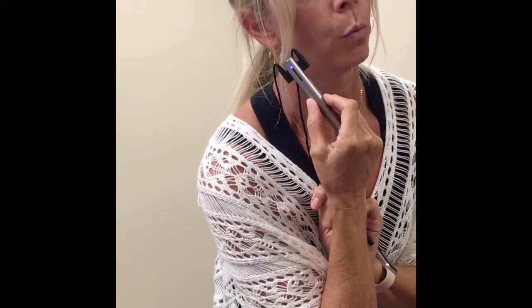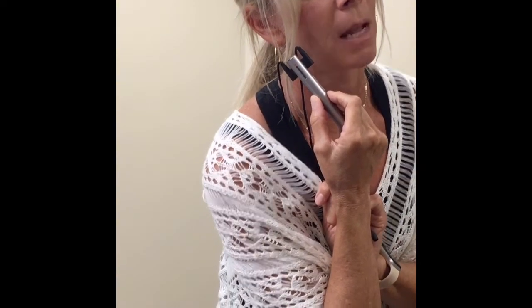that it flashed blue. Hang on. No, there we go. Watch the cycle. It's going to flash blue, blue, blue, blue, blue, red. That means it did not connect. Okay, if you see a red light, it means it didn't connect. If it connected, you will only see blue lights flashing.